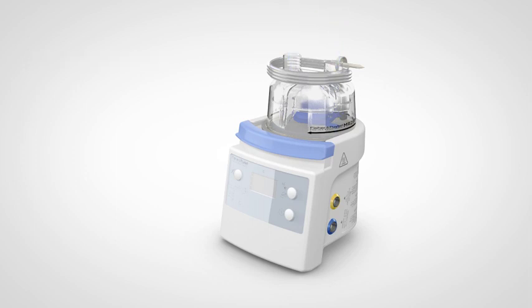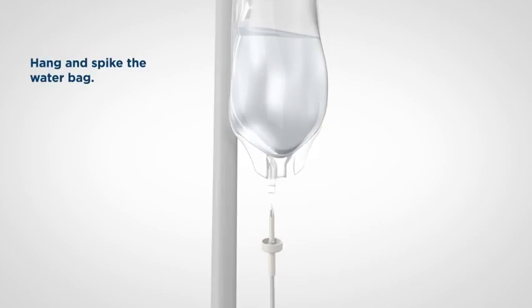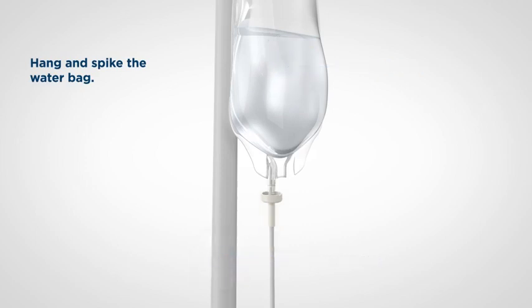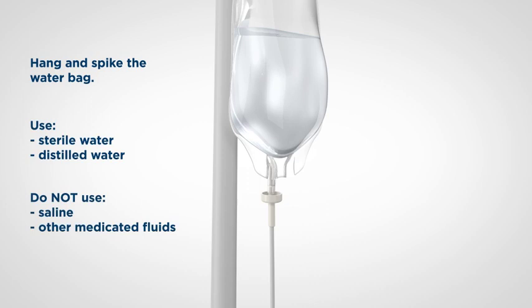Under the port caps there is a water feed tube holder. Unwind and remove the water feed tube. If you're ready to use the system immediately, hang a water bag on the water bag pole and spike the water bag. If you are setting up for future use, the water feed set holder can be used to protect and keep the water bag spiked clean. Use sterile or distilled water. Do not use saline or any medicated fluid, such as glucose.